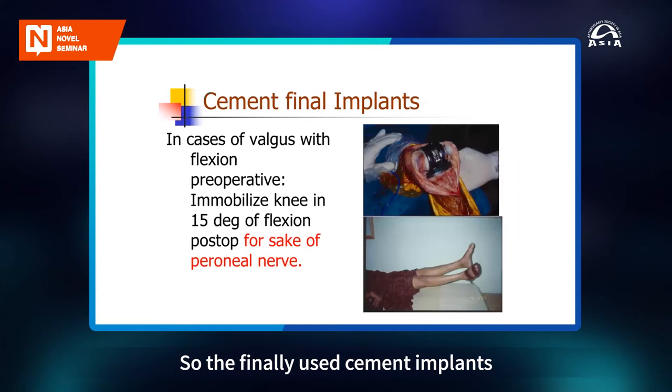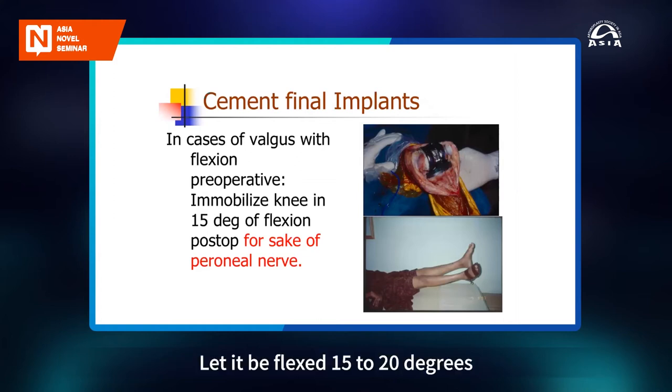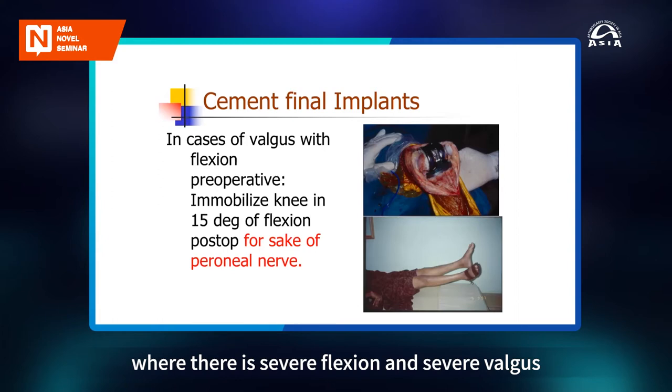So finally, you cement the implants. In case there is valgus that you have corrected, you must leave the knee post-operatively, don't straighten the full knee in the recovery. Let it be flexed 15 to 20 degrees so that the nerve is not immediately stretched. Even when you are cementing, don't put too much force in extension. It is better in these cases where there is severe flexion and severe valgus.